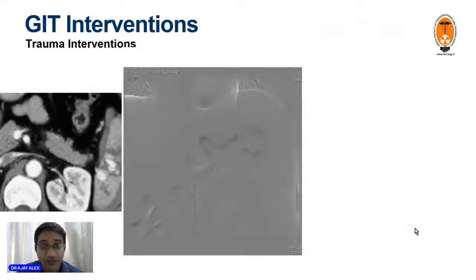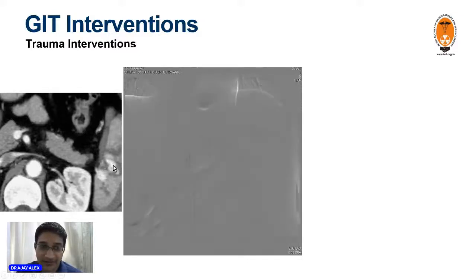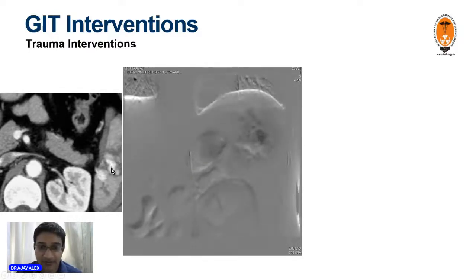We have also come to the rescue of patients who come to the casualty with trauma related injuries, especially splenic injuries, as in this case of a splenic laceration with splenic arterial pseudoaneurysm and fistula formation.